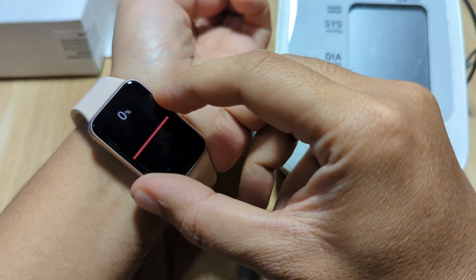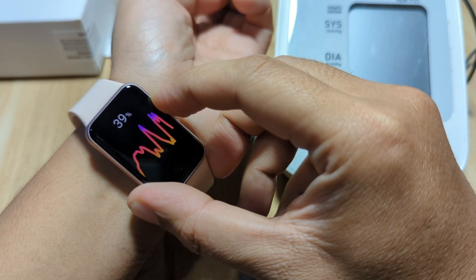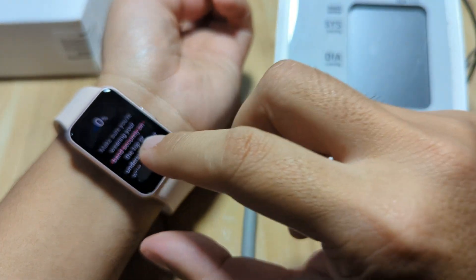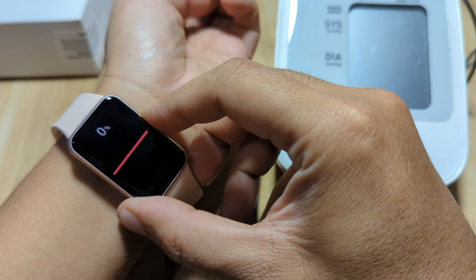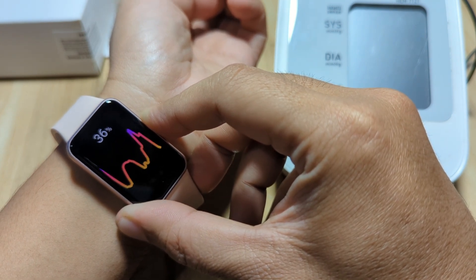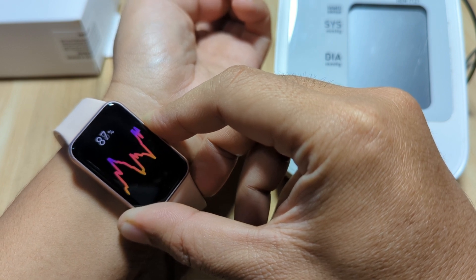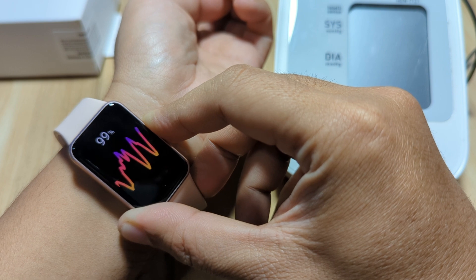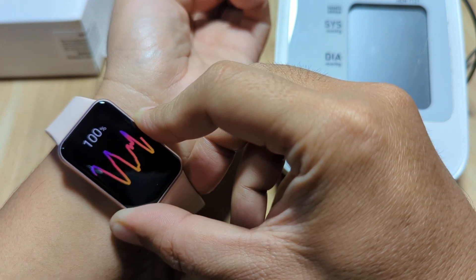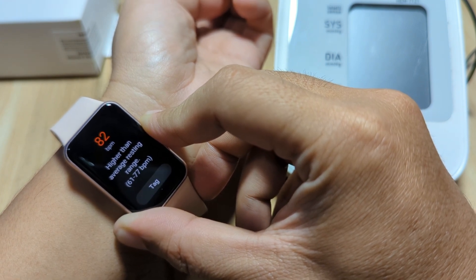It's not detecting our heart rate as you can see here. If I remove it, as you can see it will not continue detecting. Then when worn properly: preparing, checking, and we have the animation and the percentage of the heart rate monitoring. It's almost finished — 100% and we have here higher than average resting.